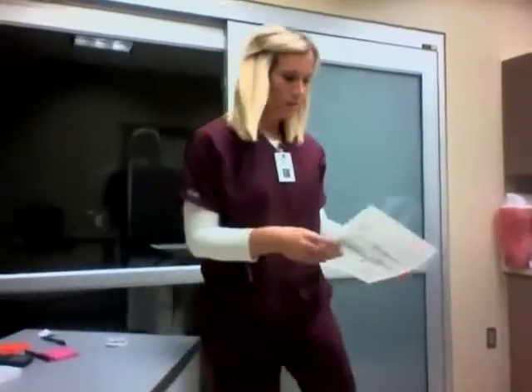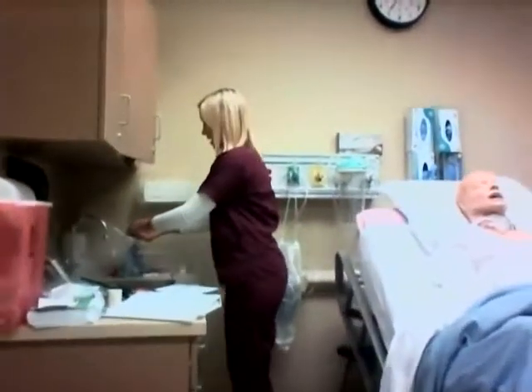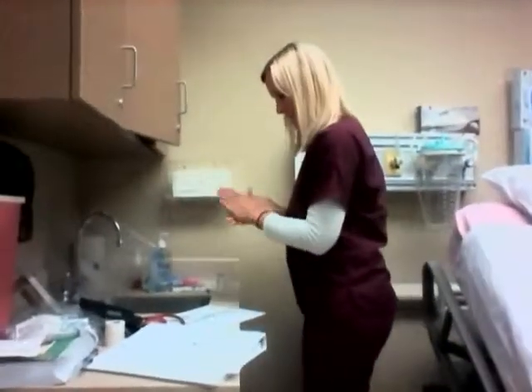Okay, so we have just gotten some new orders from the doctor for patient Pat Smith, and it is for Cardizem, an IV dose stat, and also for an IV infusion. So I'm going to go to my med room and get my medication. I'm going to wash my hands here, and then I'm going to get the Cardizem.